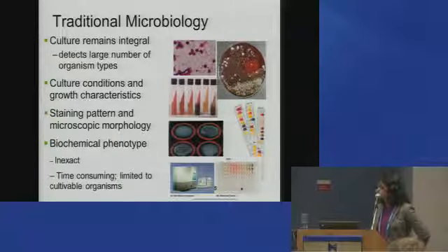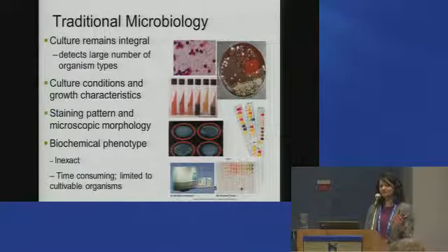So right at the foremost, you should know that microbiology is a culture-based science, okay? So we still rely a lot on cultures. I can't imagine not ever having cultures, because if you look at a patient specimen that comes to us, we have to find out from this culture what is important for us to tell our clinicians. We don't want to be giving out normal flora results. We really need to focus on pathogens, like looking for a needle in a haystack, if you will, to really give our relevant answers and not irrelevant answers.